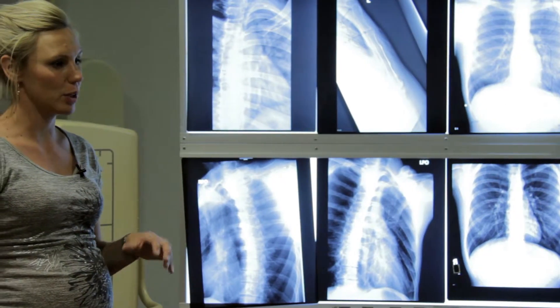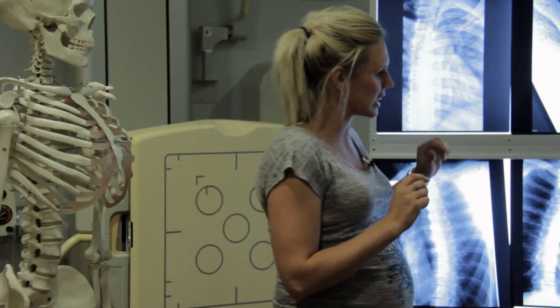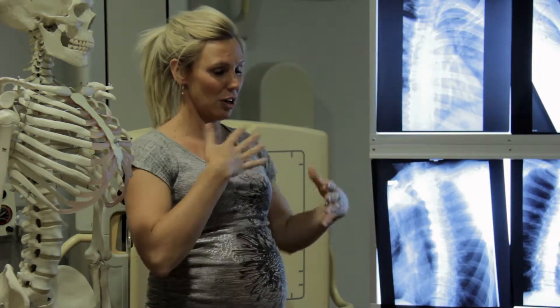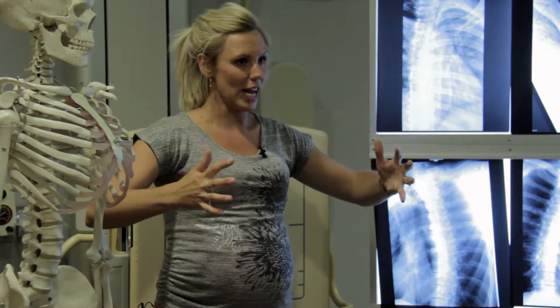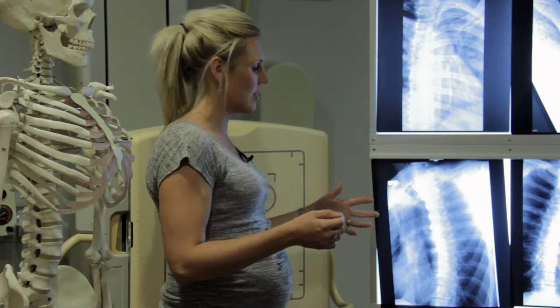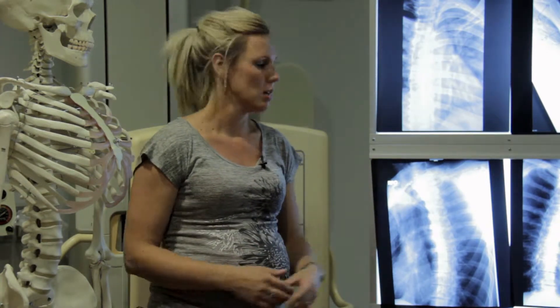Two obliques along with just the straight AP or PA — that is your upper rib series. One thing about those obliques: it's an average of 45 degrees. Well, it kind of depends on body habitus. Just like with a lot of thorax, their ribs are going to really curl around, and you'll need a lot more oblique to lay those out. Otherwise we get a funny little curl at the end and can't see the entire rib. If they have a very thin thorax, not very deep front to back, you might need a little bit more angle. Whereas a patient who's very barrel-chested, their angle is a lot less — if you roll them up to a 45, you'll really overshadow a lot of the posterior rib. A 45 is a nice average, but if they're thin, go a little more; if they're barrel-chested, go a little bit less.